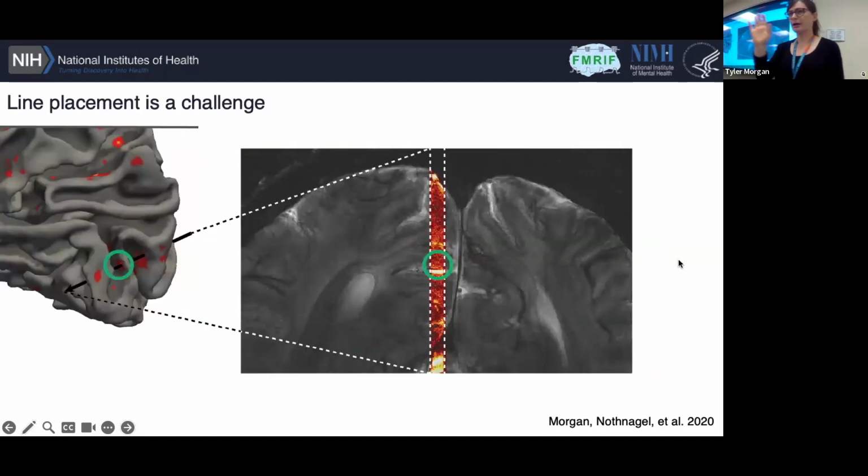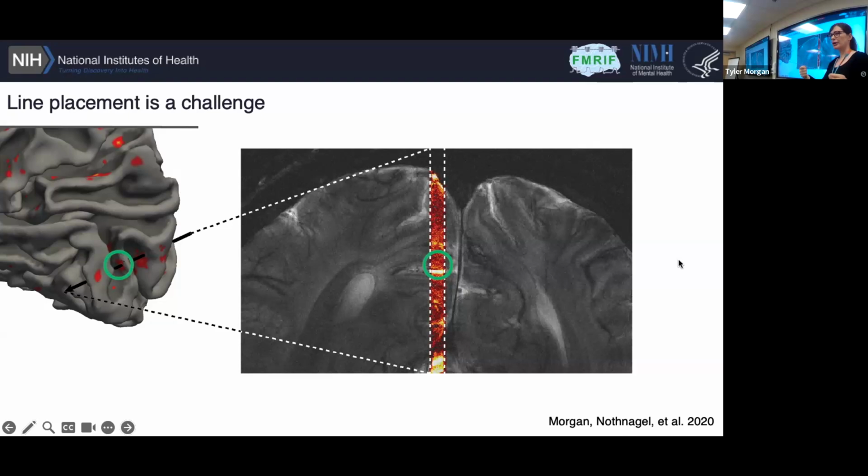Now, coming back to your question that had to do with profile, choosing profiles is really difficult in line scanning, and it takes a lot of pre-planning. It's not as easy as just putting people in the scanner and going. That's partially because the patch of interest that you're normally looking at in experiments like this is really difficult to work with. You need to know a lot of information before you start. But secondly, you also need to know where you are in navigating on the MRI machine.